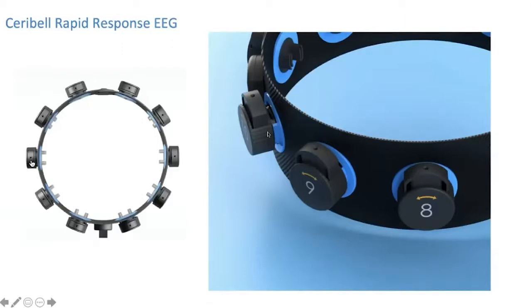The setup allows for quick attachment of the electrodes, and this is what you see in front of you here: the 10 electrodes are all in one band, pre-configured, so there's no measurement or layout, which typically requires a technologist. They're wrapped around the head with placement according to landmarks, but the electrodes are conventional electrodes.